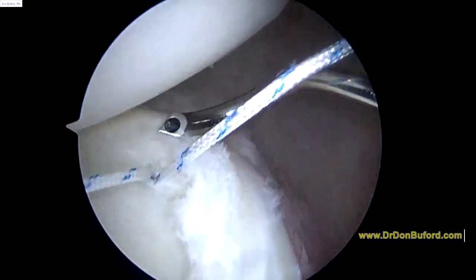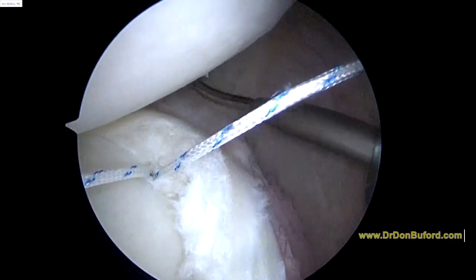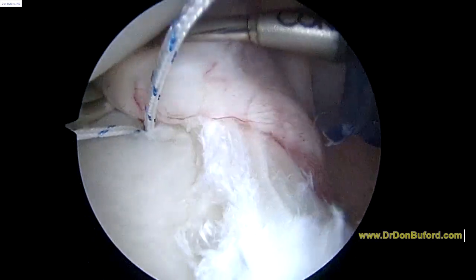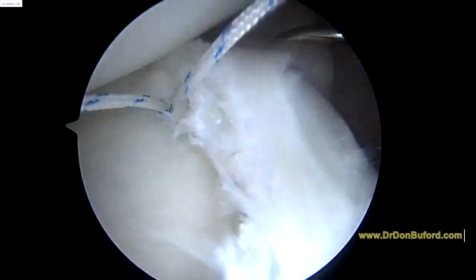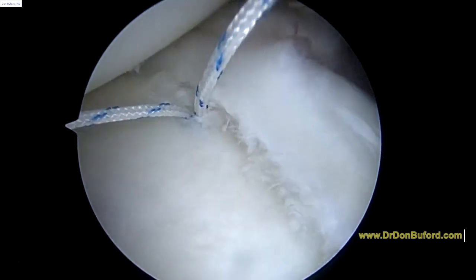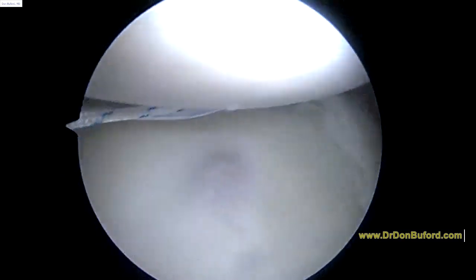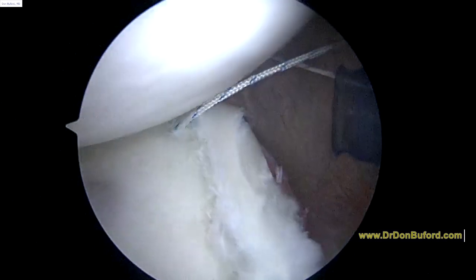Here it is. We're going to try and finish our stitch right here. So that's how we rehearse the stitch. We're going to go into the capsule right about here. So you can see how we poke through the capsule there. And then we'll bring this through just like that. You can see we've made that first pass. We're going to pull that suture all the way underneath and through. That looks like a good shot there.